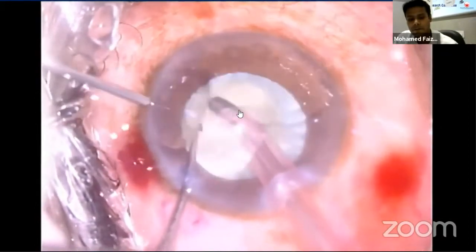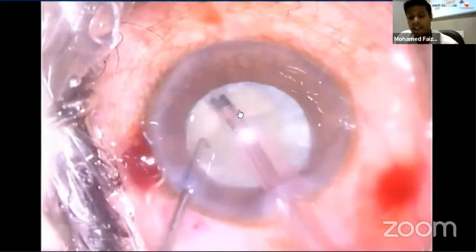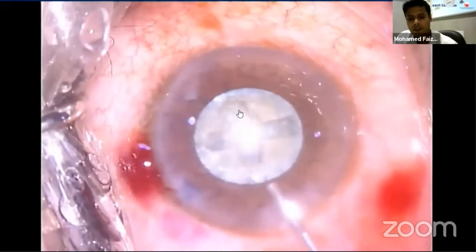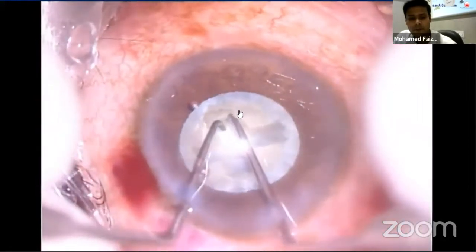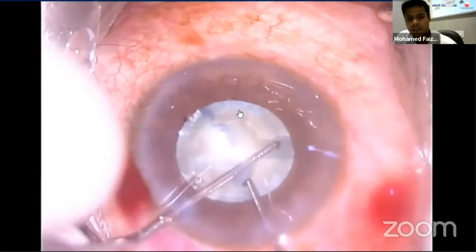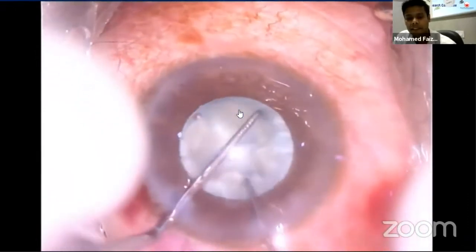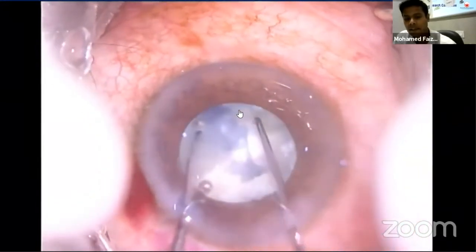Once a pair of cross grooves are created on the nucleus, it's time for cracking. Cracking can be done either with two choppers or with a chopper and FACO tip. Here I am doing conventional cracking. Both instruments are placed deep in the groove and the quadrants are separated with an outward and slightly upward motion. Make sure the posterior plate is cracked. If the crack is incomplete, the instruments can be moved towards the unsplit area and the maneuver repeated.